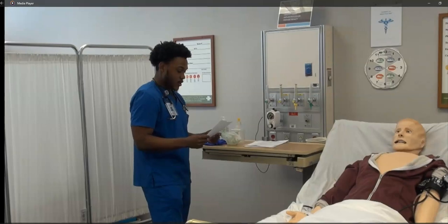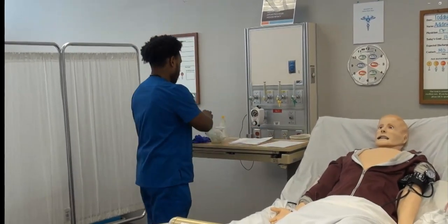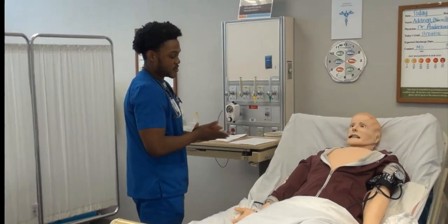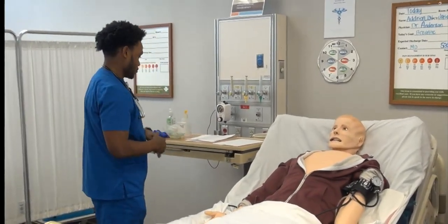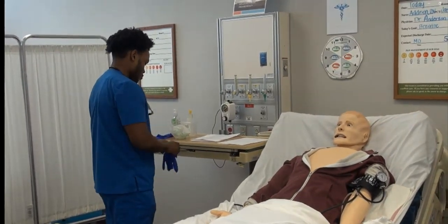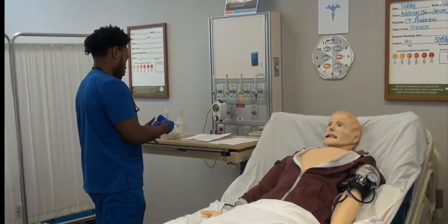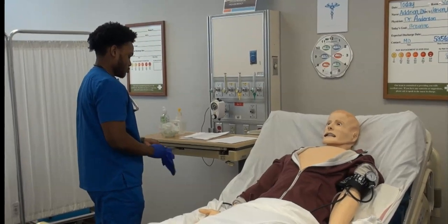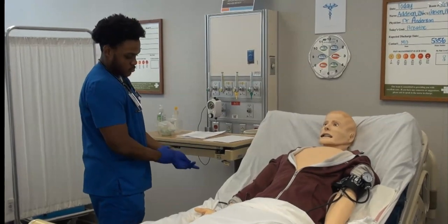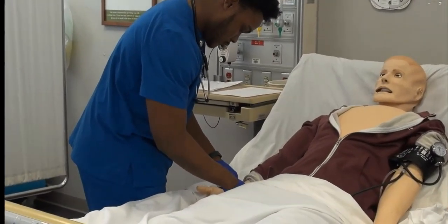Let's begin. Verify my physician's orders. Hello, Mr. St. Clair. I'm Nathan, your respiratory therapist today. May I please use your full name and date of birth? Yes. First, patient identifier. Thank you. All right, Mr. St. Clair, I'm just checking your armband just to confirm. Second, patient identifier.